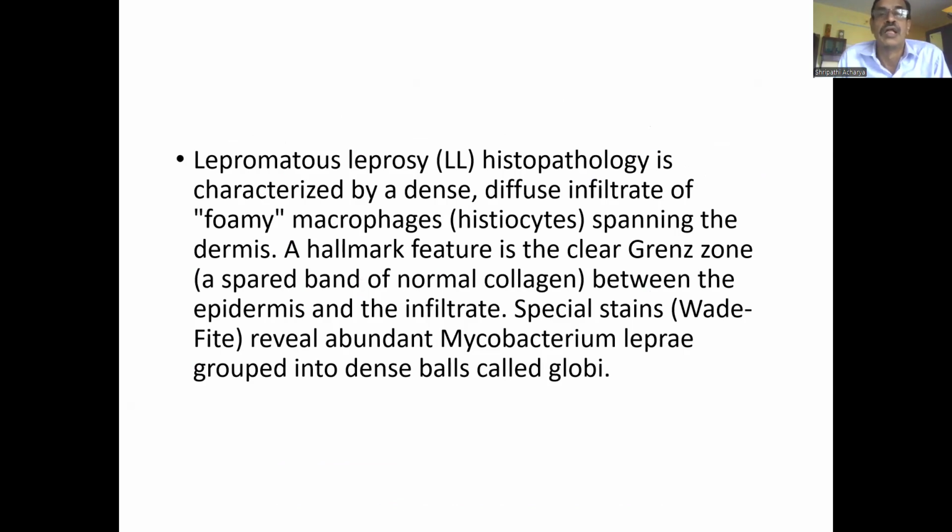Lepromatous leprosy (LL) histopathology is characterized by a dense, diffuse infiltrate of foamy macrophages, that is histiocytes, spanning the dermis. A hallmark feature is the clear Grenz zone, a spared band of normal collagen between the epidermis and the infiltrate. Special stains, like Fite, reveal abundant Mycobacterium leprae grouped into dense balls called globi.